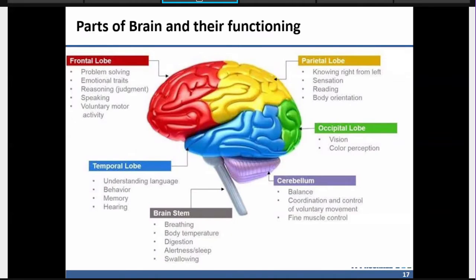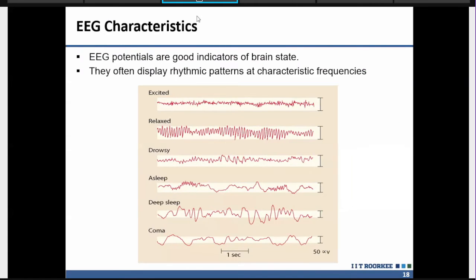So if we look at these EEG signals, they are comprised sometimes of low frequency components and sometimes of high frequency components. When we do lots of activities, or are moving, for example doing mathematical calculations, the signals will show lots of high frequency components.